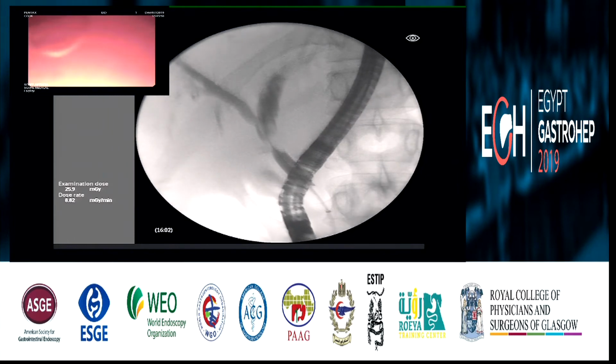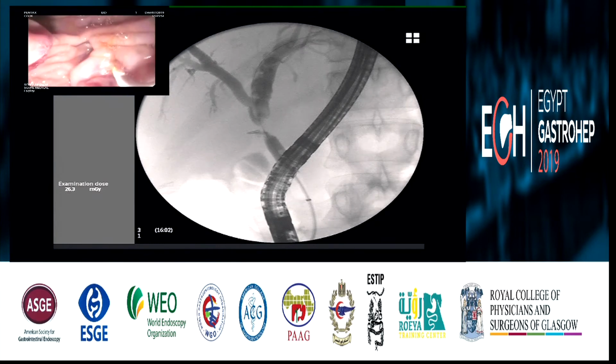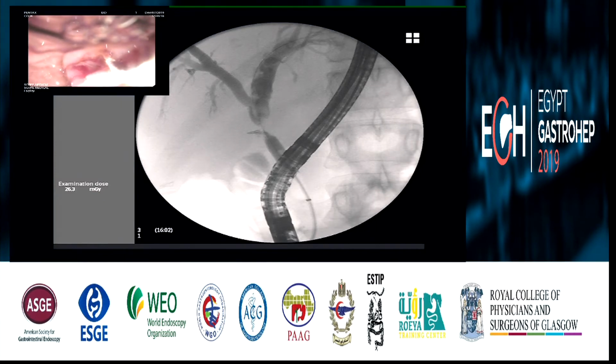If we place multiple plastic stents, then probably yes, but dilation with balloon is not always indicated in benign biliary strictures. I understand, but it might be more difficult for you to pass the stent through the stricture if you don't dilate it a little bit. Yes, if we are really good, I think we can place here also a fully covered stent. What do you think?